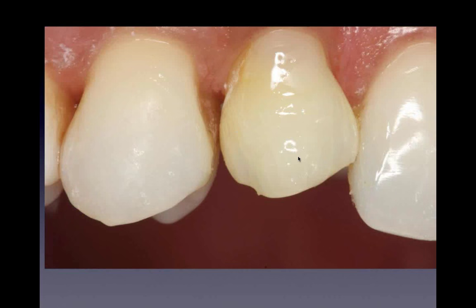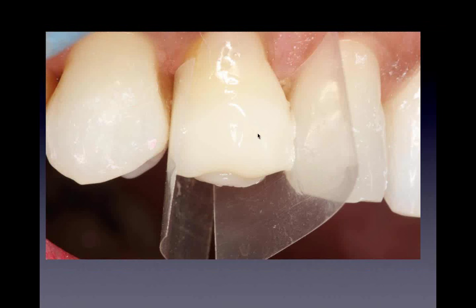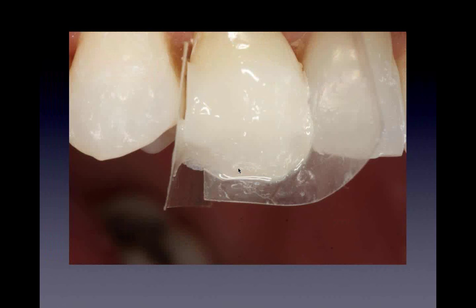We're doing our dentin bond and enamel bond. And now we put our matrices in. We put our A2 in the back and we start building up our A1, our B1. We finalize with our B1. And at the end, I put a little bit of a pearl frost, just a little bit of translucency right at the edge.